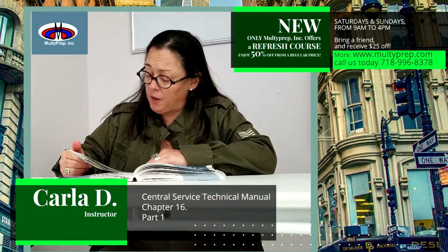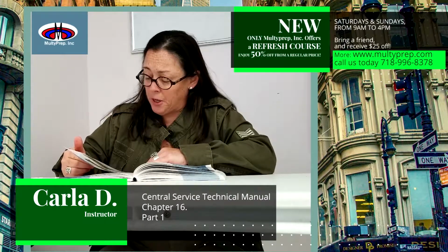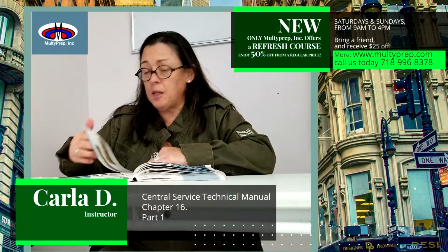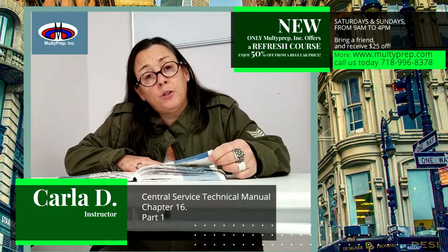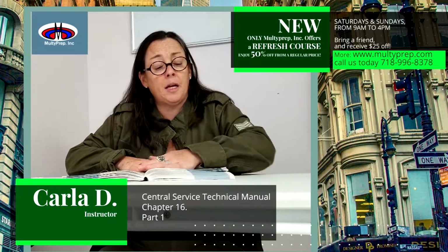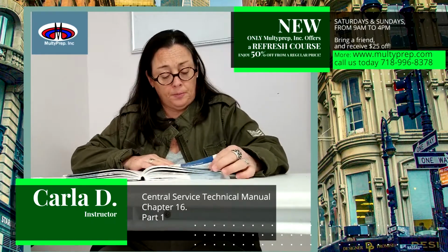This type of shelving is also expensive. However, it is very good, very versatile, user-friendly, and offers good protection for shelved items. Shelves may be solid or open wire shelves. The bottom shelf must be solid to protect the stored items from contamination. The units should be pushed to the closed position when not accessing sterile product.